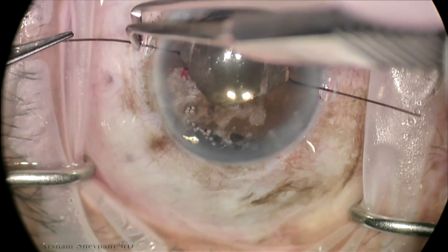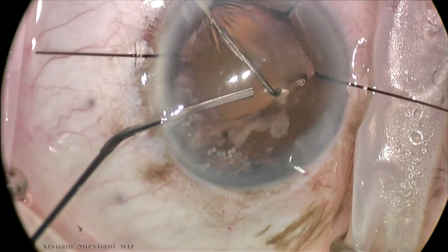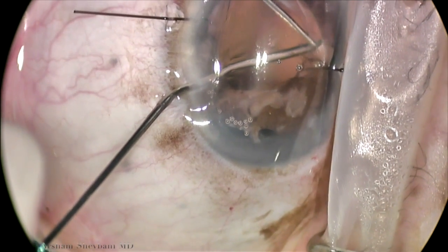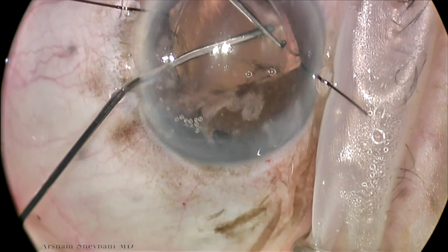We use iris hooks for better visualization after we release the iris from the anterior capsule. And using a two-handed technique, we actually use a blunted Sinskey hook to elevate the anterior capsule off of the intraocular lens, then inject a dispersive viscoelastic agent. This patient had a prior YAG capsulotomy.